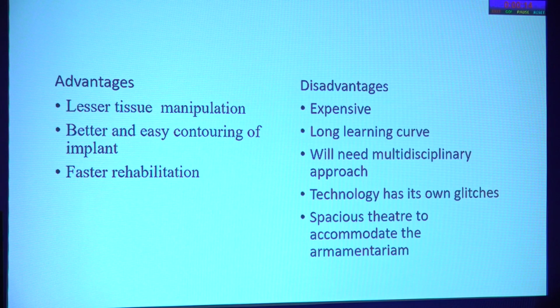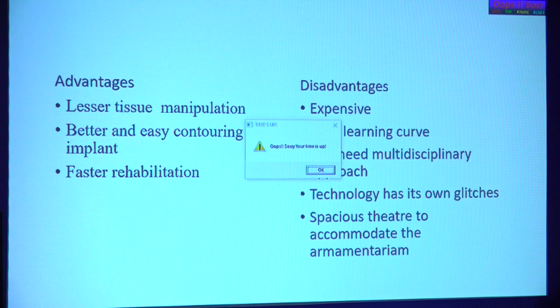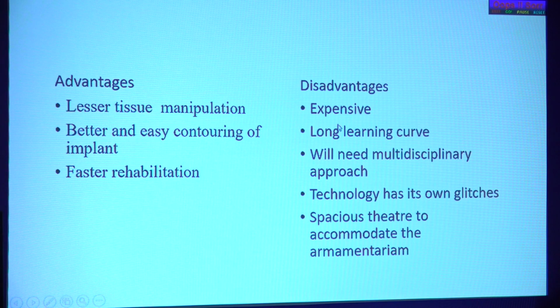Advantages: lesser tissue manipulation, better and easier contouring of the implant, and faster rehabilitation definitely. But the disadvantage is that it is very expensive. It's equal to the cost of a femto machine, I guess. When we think about returns, we might not be able to get it in a single specialty center. It has a long learning curve and will need a multidisciplinary approach. It needs a spacious theatre to accommodate the armamentarium.